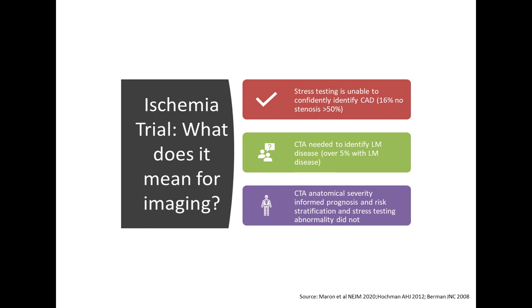As well, CT played an incredibly important role in identifying those patients with left main disease, certainly very important before we consider optimal medical therapy rather than a revascularization strategy.